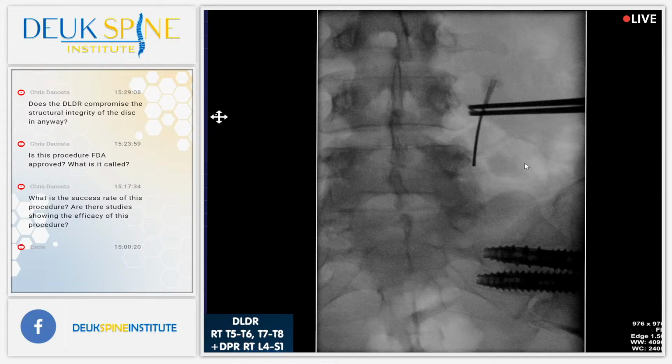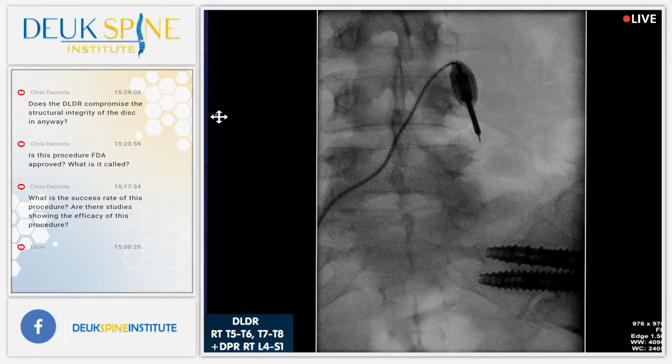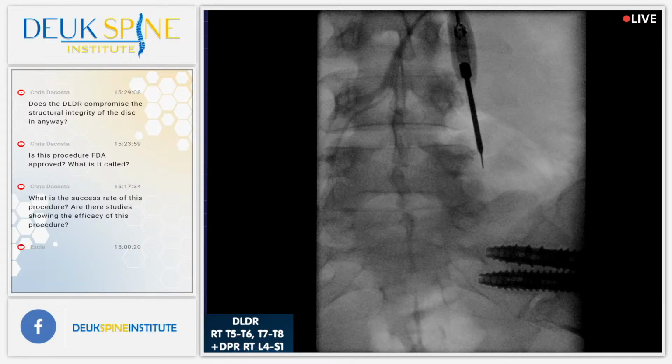That's the transverse process sticking out, and it comes back and attaches to the superior facet right where the pedicle is, the top outside corner of the pedicle. So right where those meet, that's where we want to be. That's where the bad nerve, the pain nerve lives, and that's our target, the medial branch of the dorsal ramus. The technique you're watching right now will be the technique that all doctors use eventually in the future.